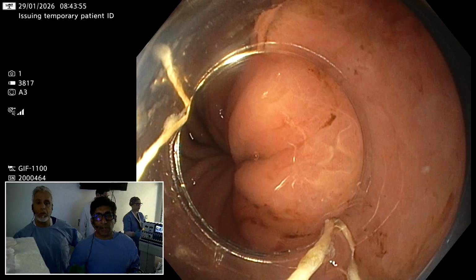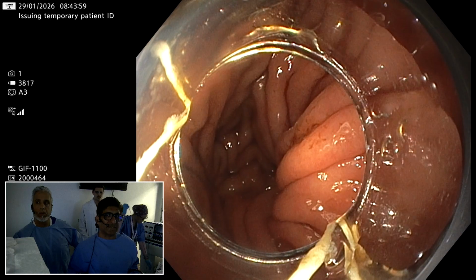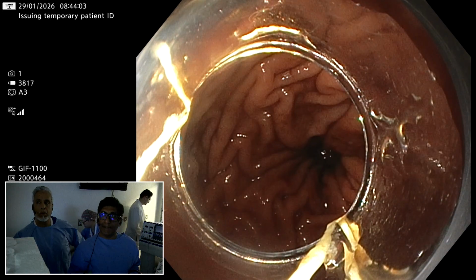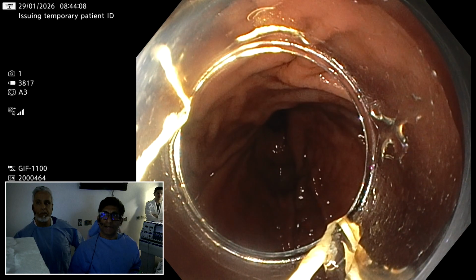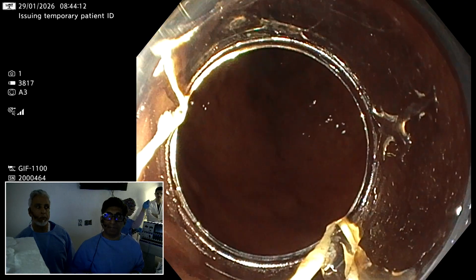If you have one lesion, you need to do endoscopy to look for others? So for duodenal endocrine tumor, the pathophysiology is different from gastric neuroendocrine tumor. In duodenal neuroendocrine tumor, you may find many tumors. You have to go up to D2 and D1, but gastric neuroendocrine tumors are totally different.